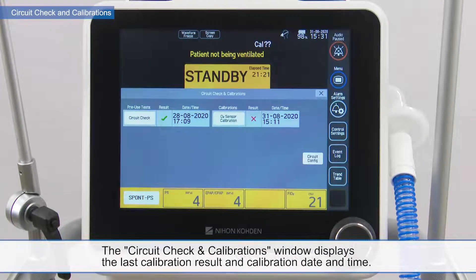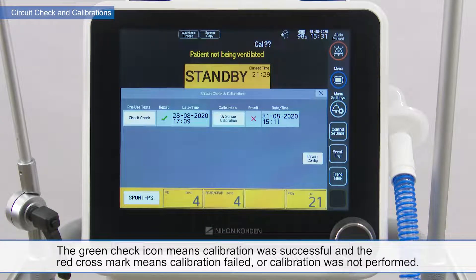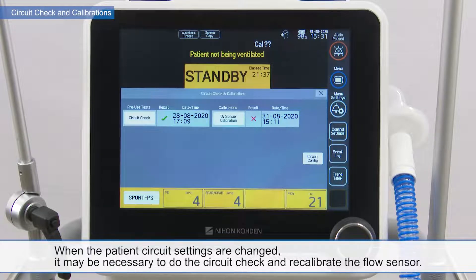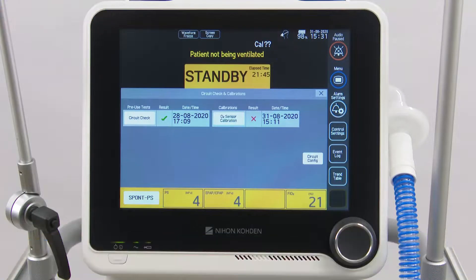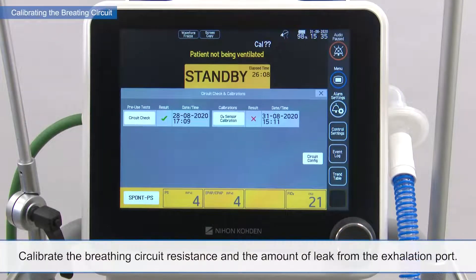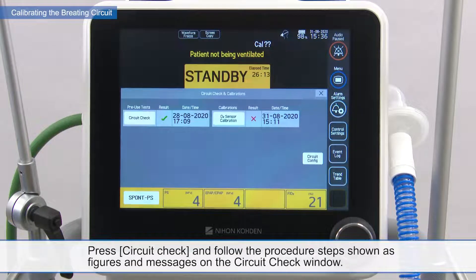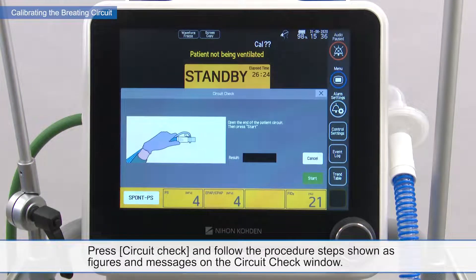The circuit check and calibrations window displays the last calibration result and calibration date and time. The green check icon means calibration was successful and the red cross mark means calibration failed or was not performed. When the patient circuit settings are changed, it may be necessary to do the circuit check and recalibrate the flow sensor. Calibrate the breathing circuit resistance and the amount of leak from the exhalation port.